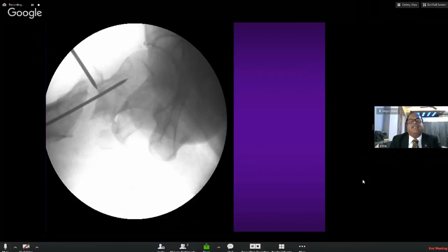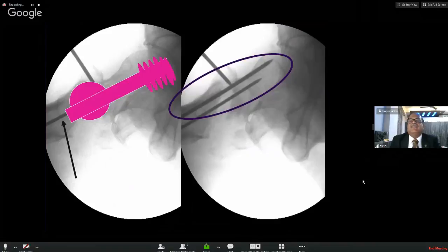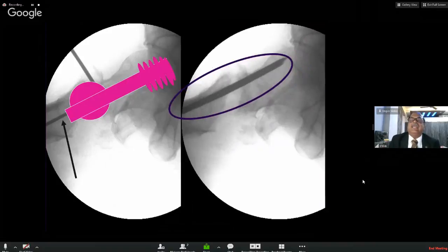You can see in this fracture, the posterior cortex is so comminuted and it is so osteoporotic, you cannot see the posterior cortex also in this case. So it's very difficult to align the posterior cortex. So I am aligning the anterior cortex. Once this K-wire is fixed, if it is coming in the way of my subsequent screw, whether I am doing DHS or PFN, what I do is I additionally insert few more K-wires anteriorly and withdraw the first one which was fixing the fractures.